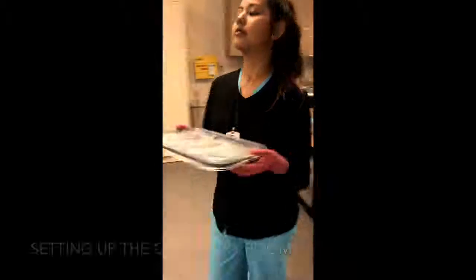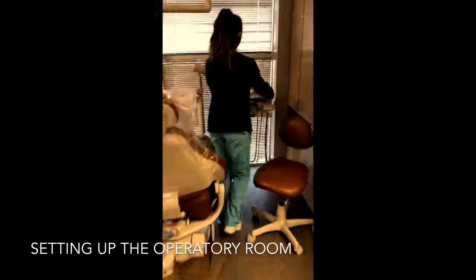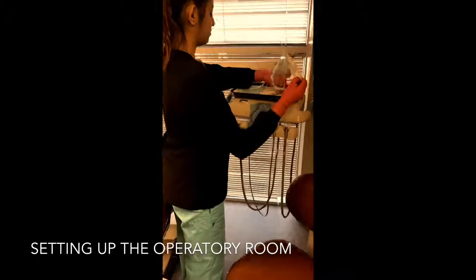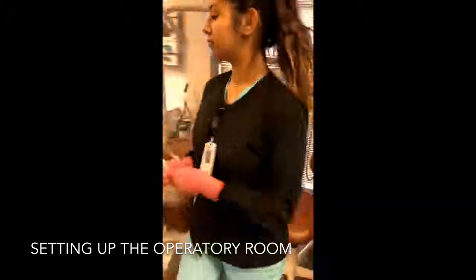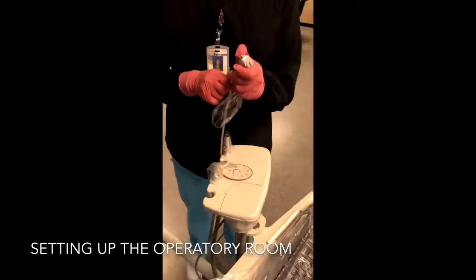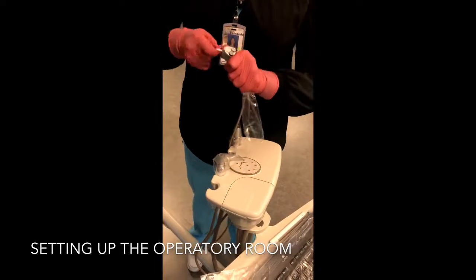And here we have Fernanda setting up the operatory room for her next patient. She has all of her essentials: her bib, her HV, air water syringe, saliva ejector, and basic setup for the doctor. Always try to make sure you're moving fast-paced so you will never keep the patient or the doctor waiting. Have everything ready and always stay persistent. Here she goes.